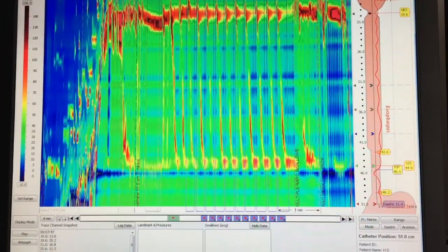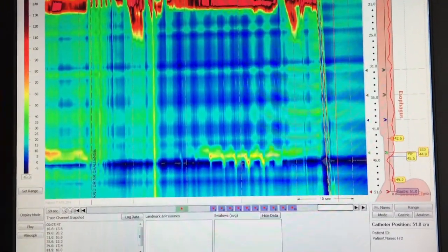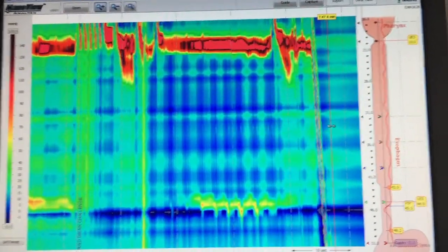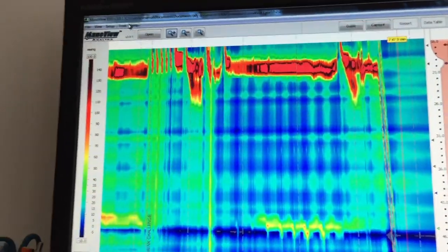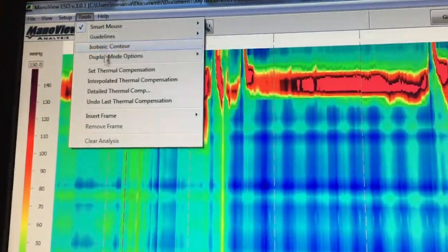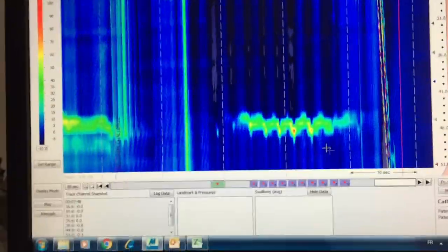The first thing to do is to expand the tracing. And according to the system you use, you may have to perform a thermal compensation. In this case, I put the cursor at the end of the tracing and go up in the tools to select the thermal compensation. The thermal compensation is done.